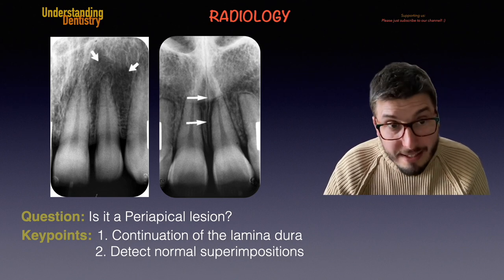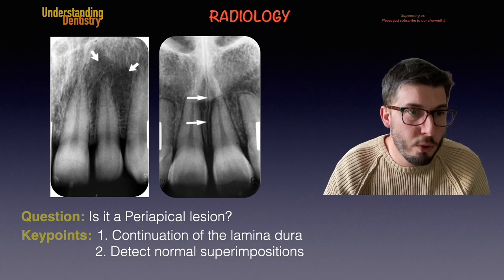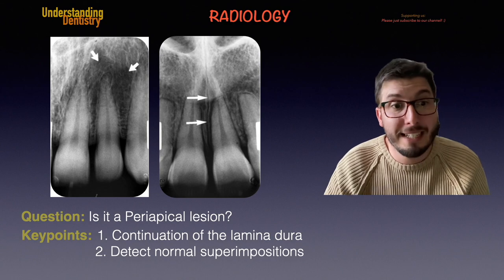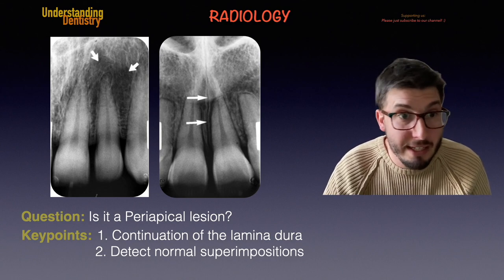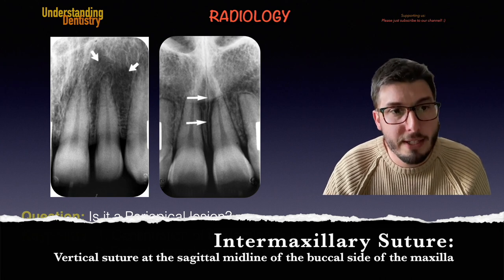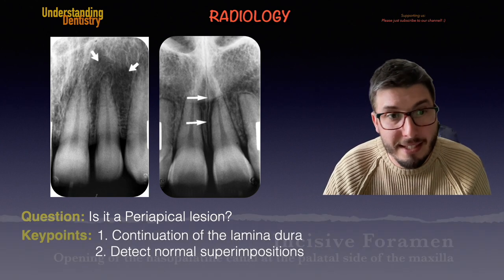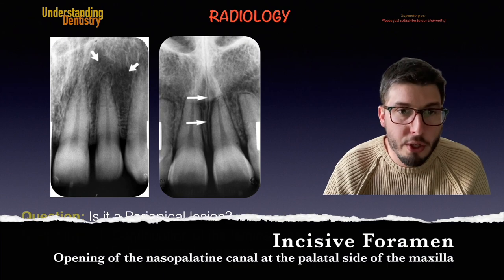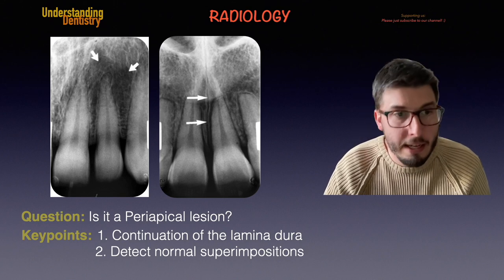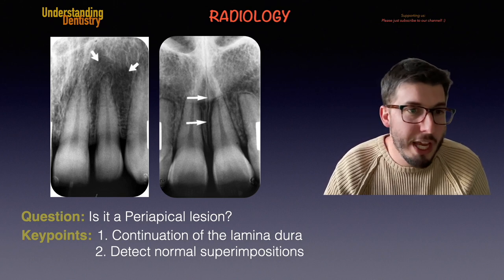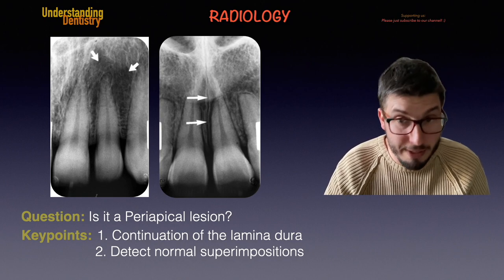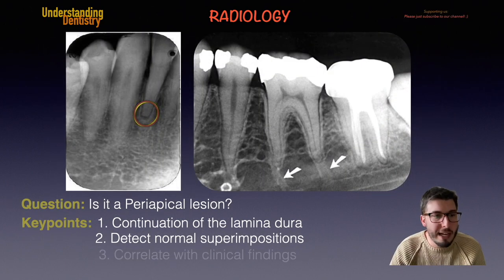In the radiograph on the right side, we have two radiolucent images superimposed on each other. The line marked by the white arrows is the intermaxillary suture, whereas the shadow behind it is the incisive foramen. One structure is on the buccal side, the other — the foramen — is on the palatal side. But we can still follow the shapes of the lamina dura and confirm this is normal anatomy, not a lesion.